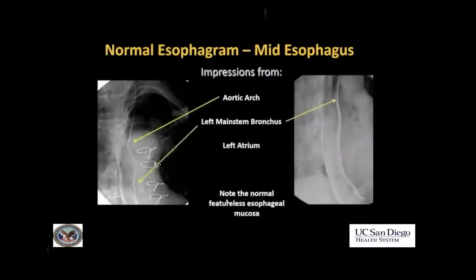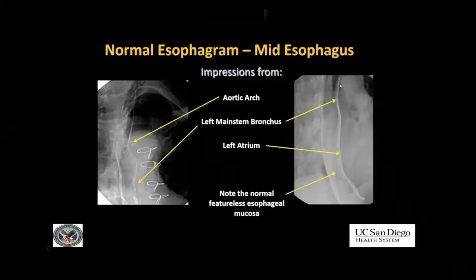There are three normal indentations on the esophagus. The first one is the aortic arch, seen here. The second is the left main bronchus, also better seen here where you can actually see the lucency of the left main bronchus crossing over and putting a little indentation on the esophagus. And the third normal indentation is the left atrium, which is going to be more marked in patients who have a large left atrium. So: aortic arch, left main stem bronchus, and left atrium — those are the normal impressions you will often see on the esophagus.